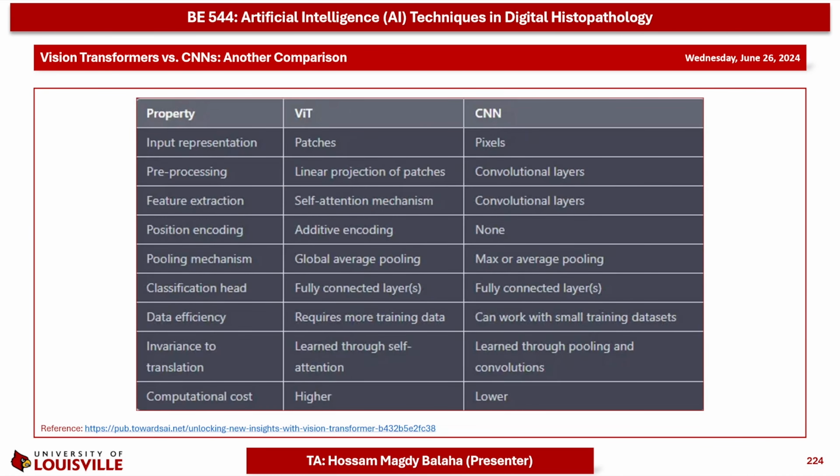And this is another simple comparison between ViT, or vision transformers, and CNNs. So in this lecture, we have dealt with vision transformers, understood the meaning and the theory behind them, and discussed the different components, beginning by splitting the image into patches, then embedding them and prepending the class token, then applying the encoder or multiple cascaded encoders sequentially, and then applying the classification head that provides the logits, which are then passed to the softmax function, and finally getting the prediction.